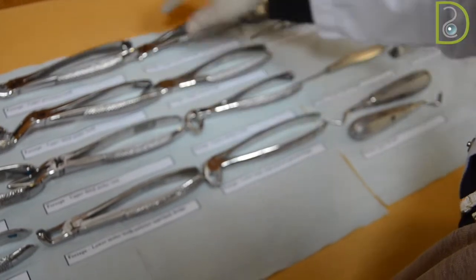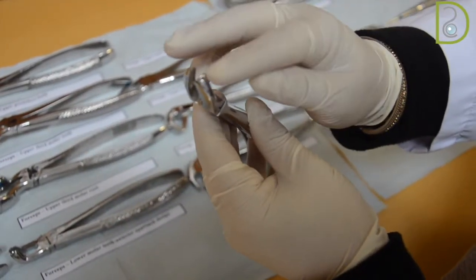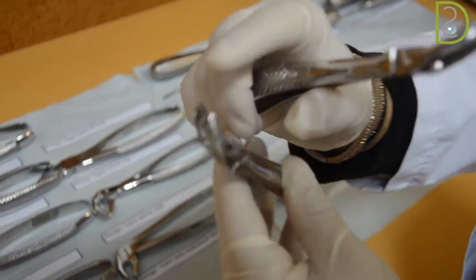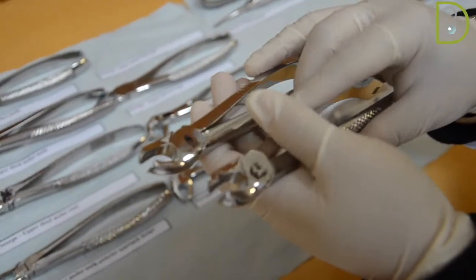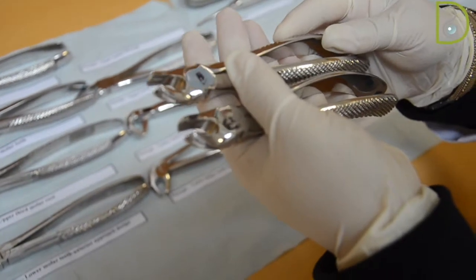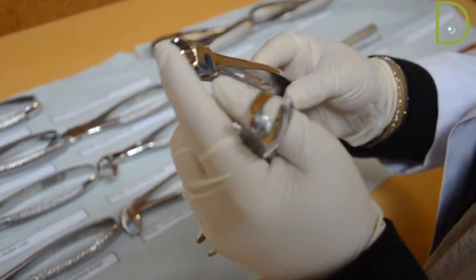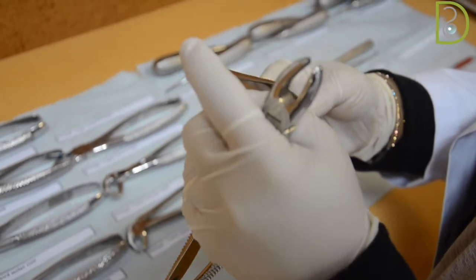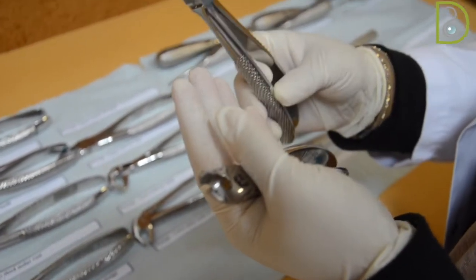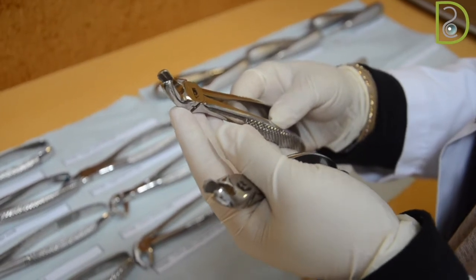Now we will come to the first and second molar forceps, the upper ones. You will see that the two beaks are not similar to each other. One of the beaks will have a small tiny projection, because the upper molar teeth have three roots, with the two buccal roots having the furcation area, while the palatal root is totally cylindrical. So any beak without the projection is considered the palatal beak, while the one with the projection is considered the buccal one. For this purpose we have a left one and a right one. These are majorly for the extraction of the upper first and second molar teeth.